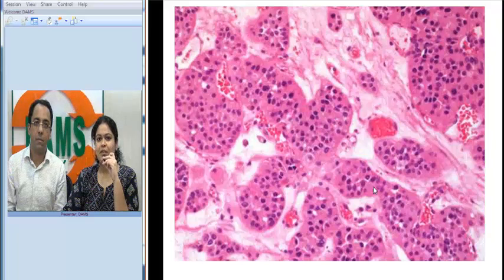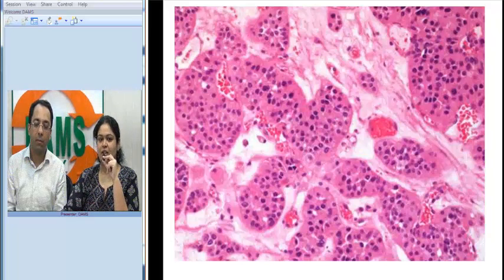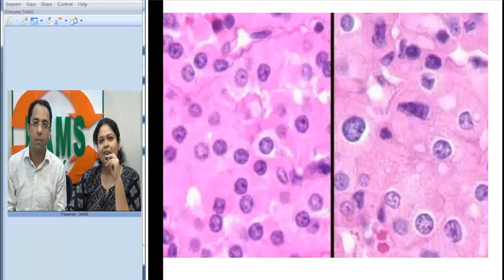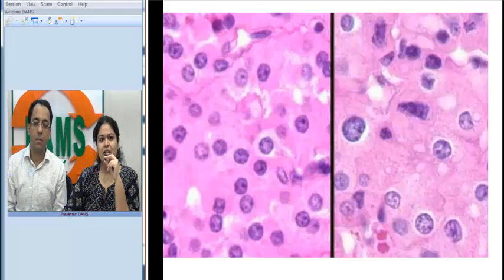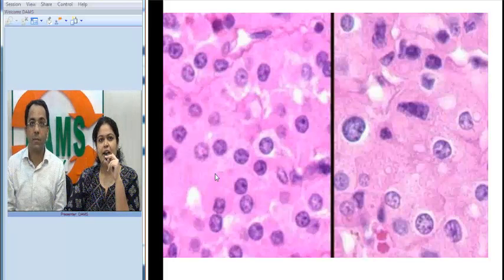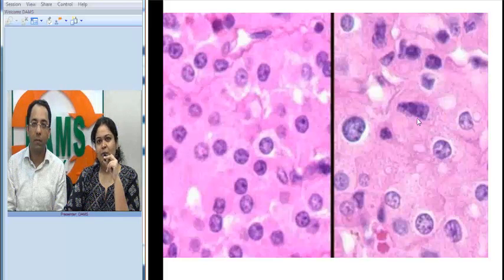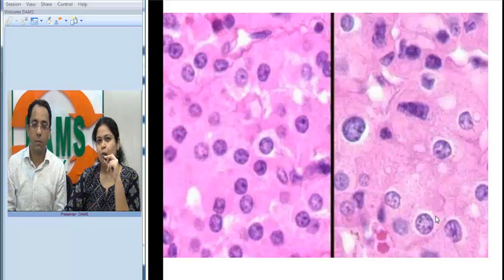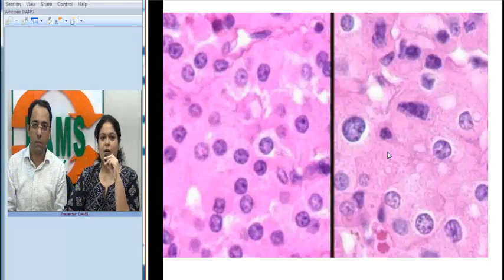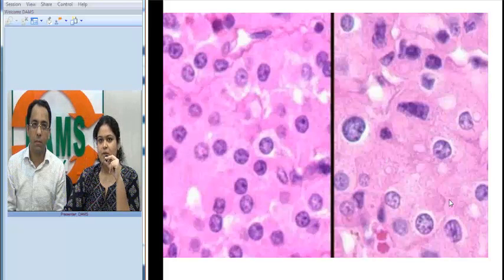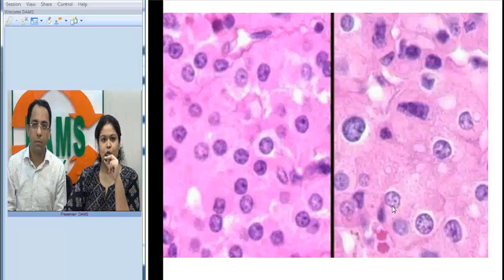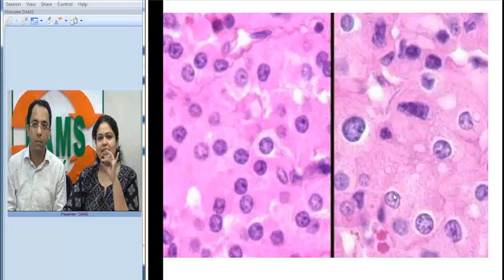One difficulty pathologists face on microscopy is differentiating oncocytoma from chromophobe RCC. On the left we see cells that are mostly uniform with round nuclei and fine chromatin — that is oncocytoma. On the right, the nuclei are different-sized with a perinuclear halo, which is characteristic of chromophobe RCC. We can also use two markers: CK7, which is positive in chromophobe RCC, and Hale's colloidal iron, which is diffusely and strongly positive in chromophobe RCC. So as pathologists, our problem is solved using microscopy, IHC, and special stains.